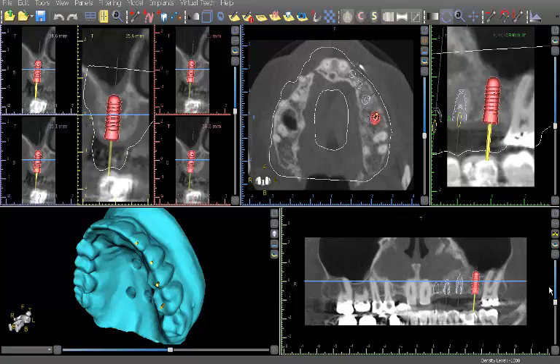We at Guided Surgery Solutions have attempted to streamline the virtual planning process by incorporating scans of readily available models into the Blue Sky Plan implant planning software.